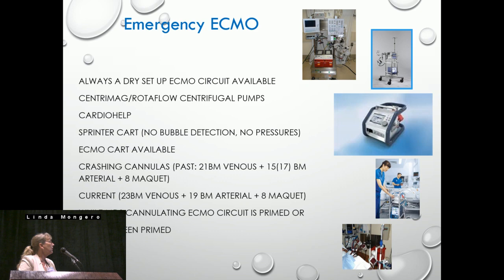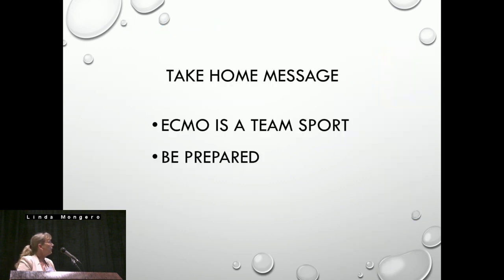While physicians are cannulating, the ECMO circuit is primed, we're already primed and ready to go. So the take-home message is exactly what everybody was saying this morning. ECMO is a team sport, and always be prepared.